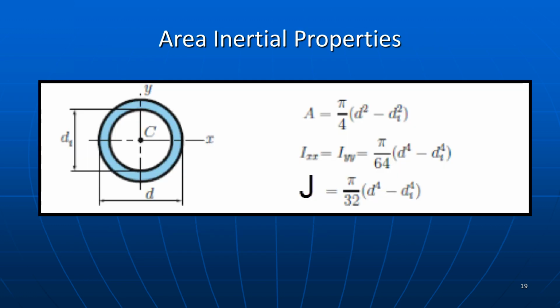Given that we now understand the equations governing the materials in the CathCAD software, we now define the equations involving the area inertial properties of the catheter design. These equations are provided to the user for a single lumen catheter design. These terms are automatically computed in the software by the user entering and defining the catheter inner diameter, outer diameter, and the individual layer thicknesses.